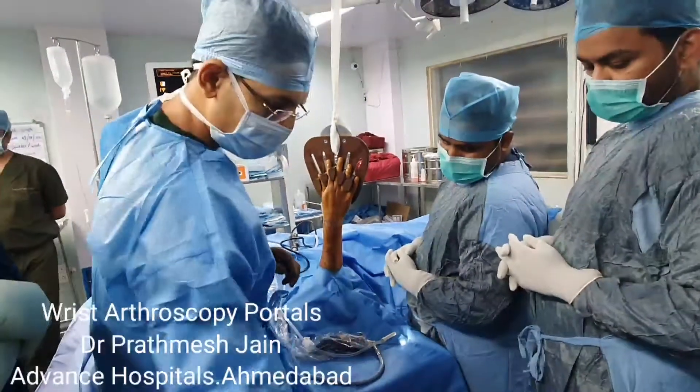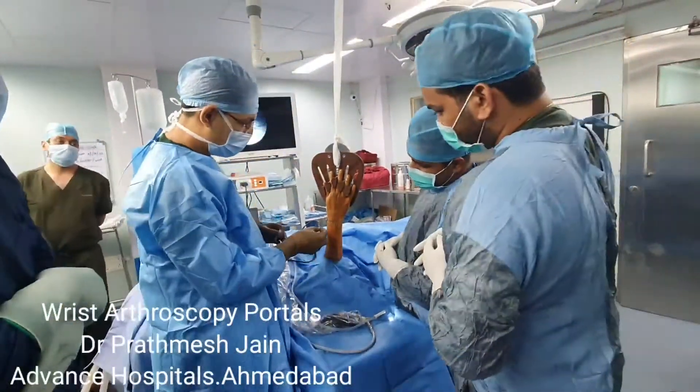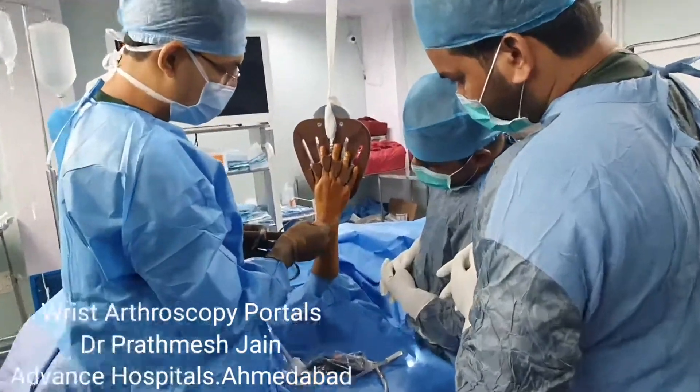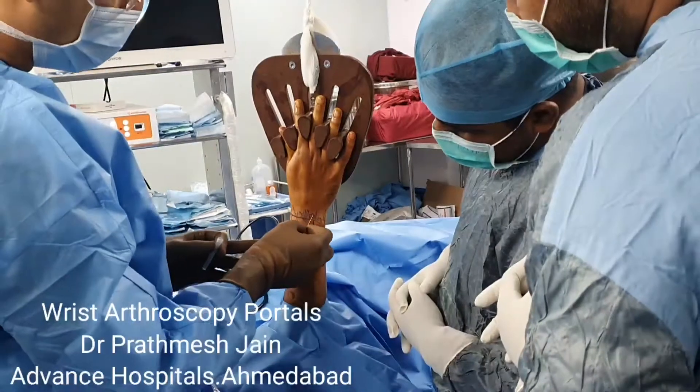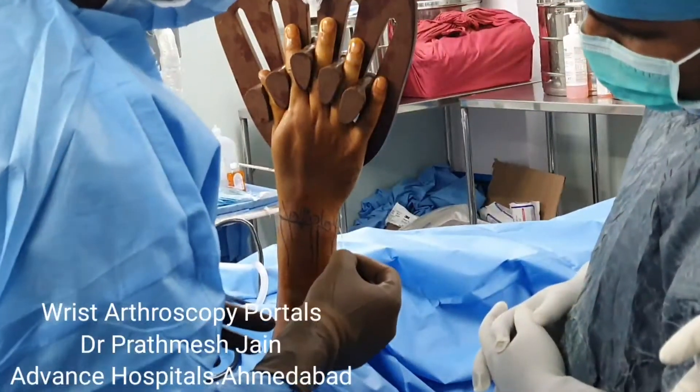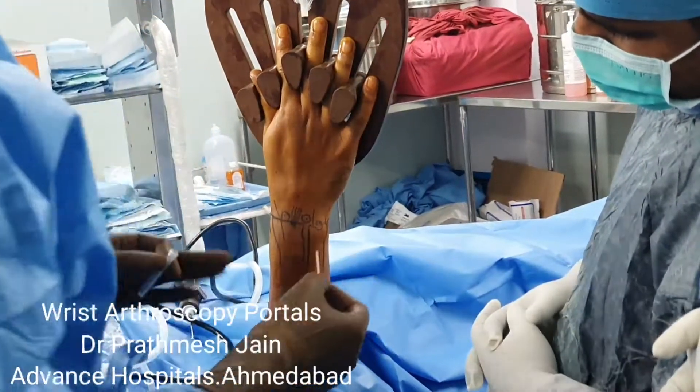The most commonly used portal is the 3-4 portal, which is the initial portal, working portal, or viewing portal. Then there is the 4-5 portal, and then you have the 6U and 6R portals here.